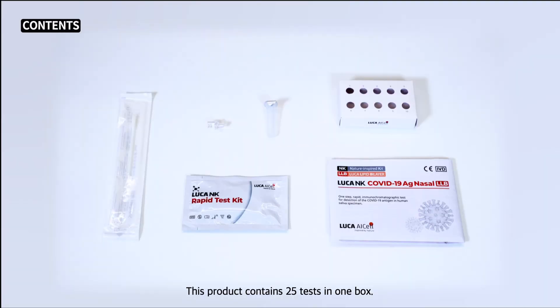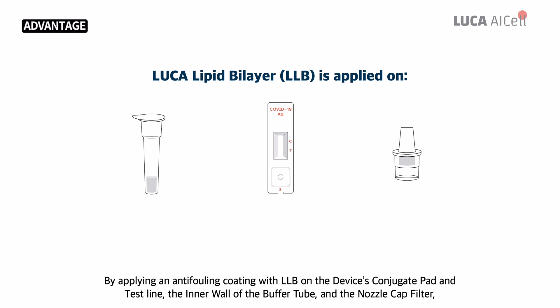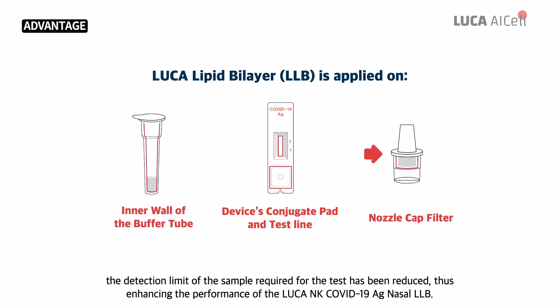This product contains 25 tests in one box. By applying an anti-fouling coating with LLB on the device's conjugate pad and test line, the inner wall of the buffer tube, and the nozzle cap filter, the detection limit of the sampler required for the test is then reduced, thus enhancing the performance of the Luca NK COVID-19 AG Nasal LLB.